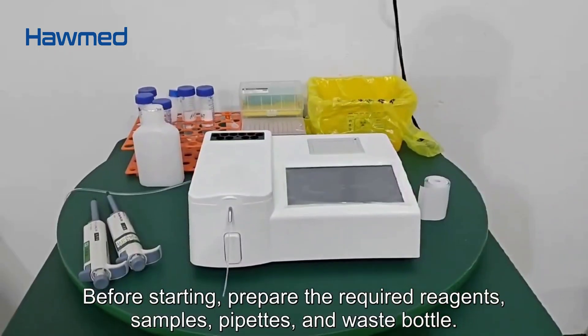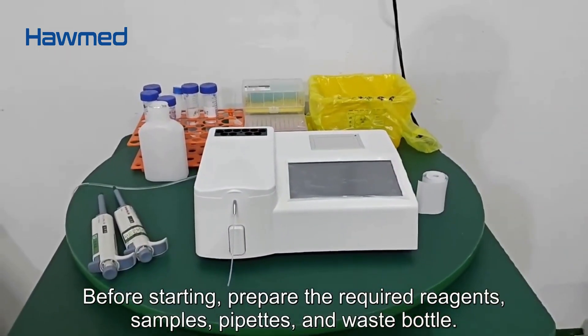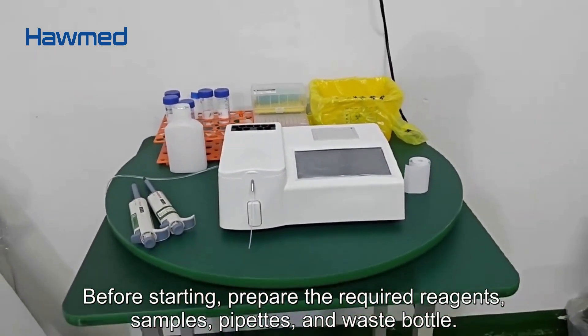Before starting, prepare the required reagents, samples, pipettes, and waste bottle.